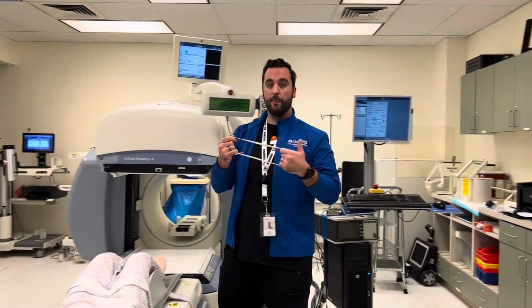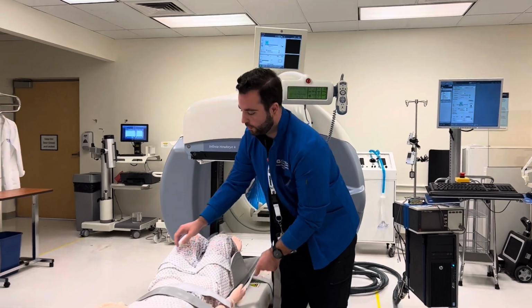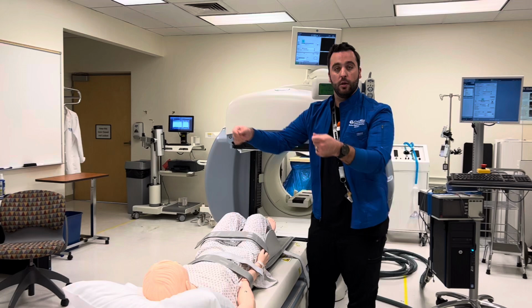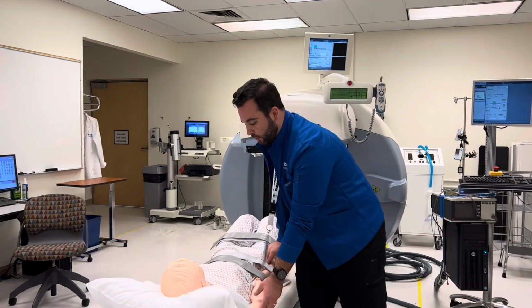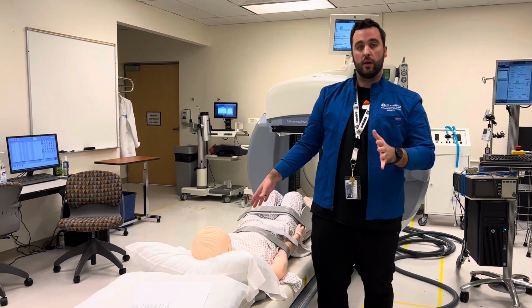You're going to take your binding for the feet, make sure the feet are nice and straight. Make sure she's comfortable. You're going to ask her if she wants a blanket. And then if she wants a blanket, you can cover her with a blanket. At this point, you're going to ask Rosie if she's comfortable, if she's claustrophobic, if she wants anything over her eyes. Rosie's okay for right now.